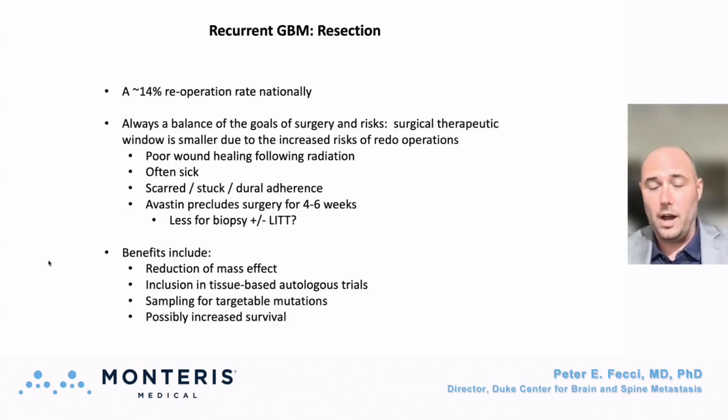They often will have their dura stuck to the cortical surface after radiation. It can be very challenging to get that dura safely off the surface of the brain. This is not a challenge that you have with the laser, of course. It may be very difficult to get lesions off of the surrounding scarred radiated white matter, and those borders may also not be clear, not an issue with LITT.